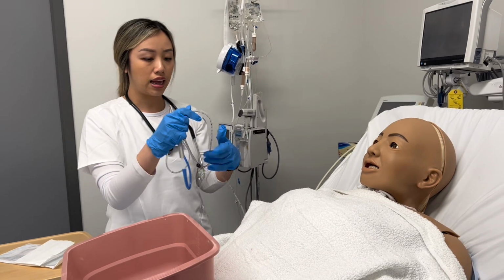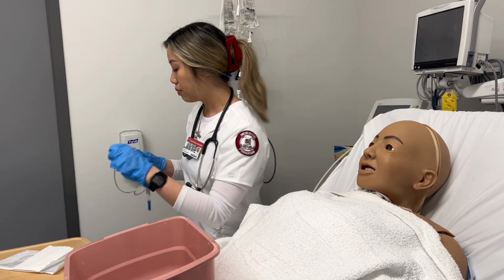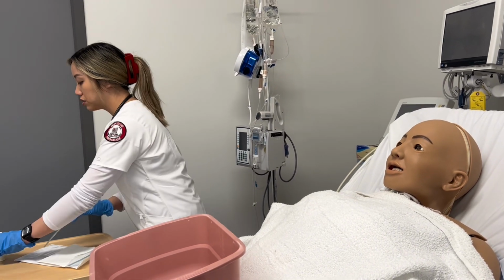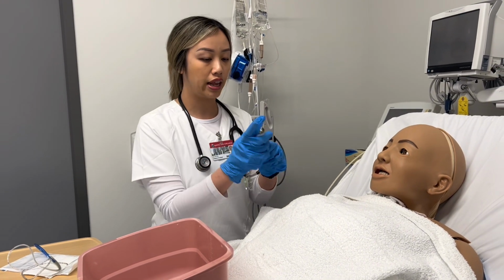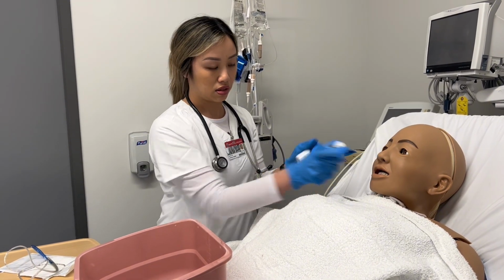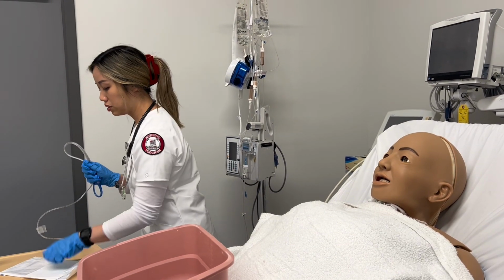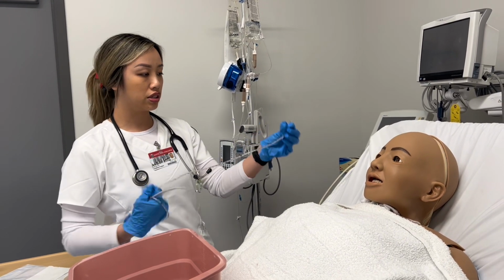Okay, so then at this time, I'll lube my tube about 2 to 4 inches. And then I'll also spray some of this lubricant in his nare as well. Okay, so I lube it 2 to 4. I'm going to start inserting the NG tube.